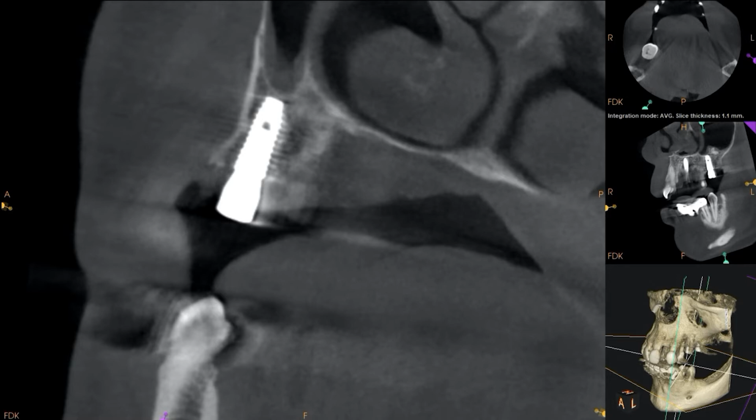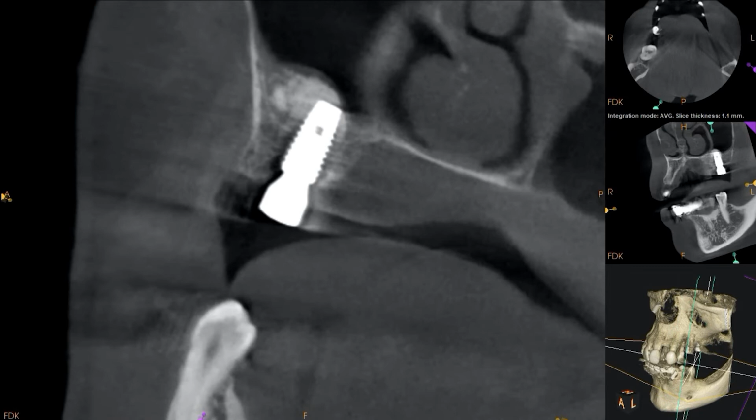I like what the CT shows us. The CT is always going to tell you the real story. Two-dimensionally, everything always looks good. At least it should. Otherwise, we probably shouldn't be done with surgery. But two-dimensionally, they look really good. Three-dimensionally, you see really what happened. So I like what I'm seeing on number 13 for sure. Let's move over to number 14.